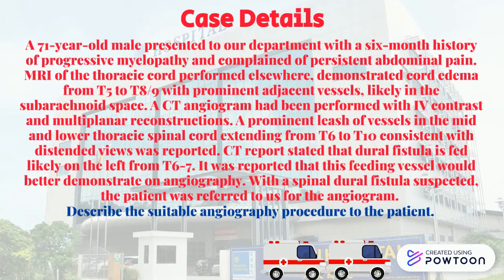CT report stated that dural fistula is fed likely on the left from T6 to T7. With a spinal dural fistula suspected, the patient was referred to us for the angiogram. Describe the suitable angiography procedure to the patient.